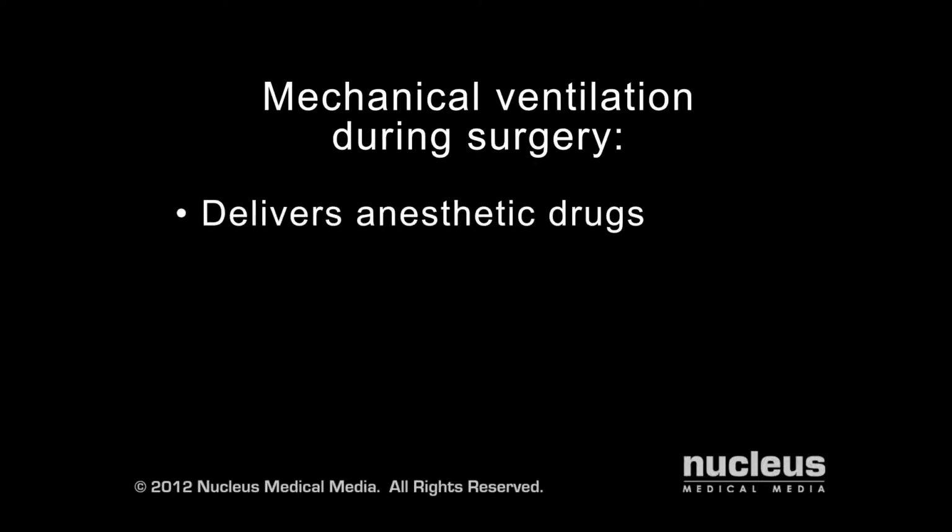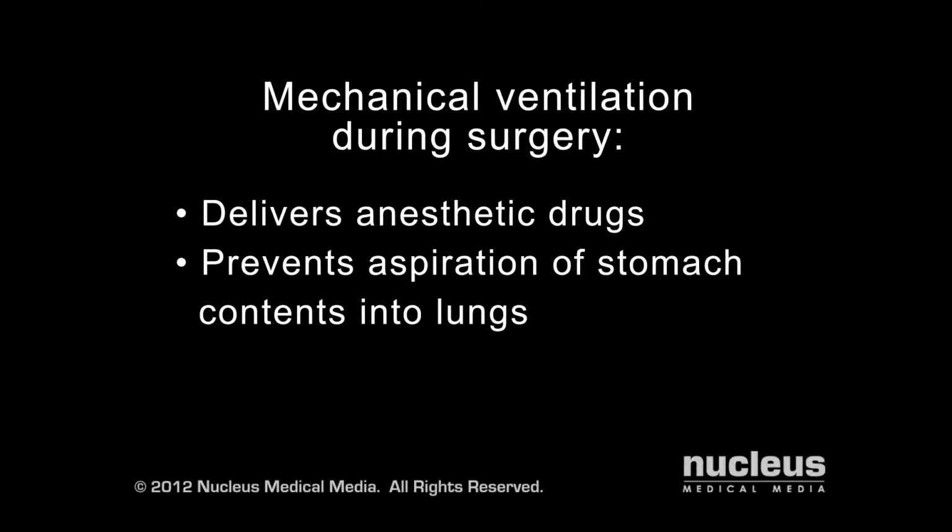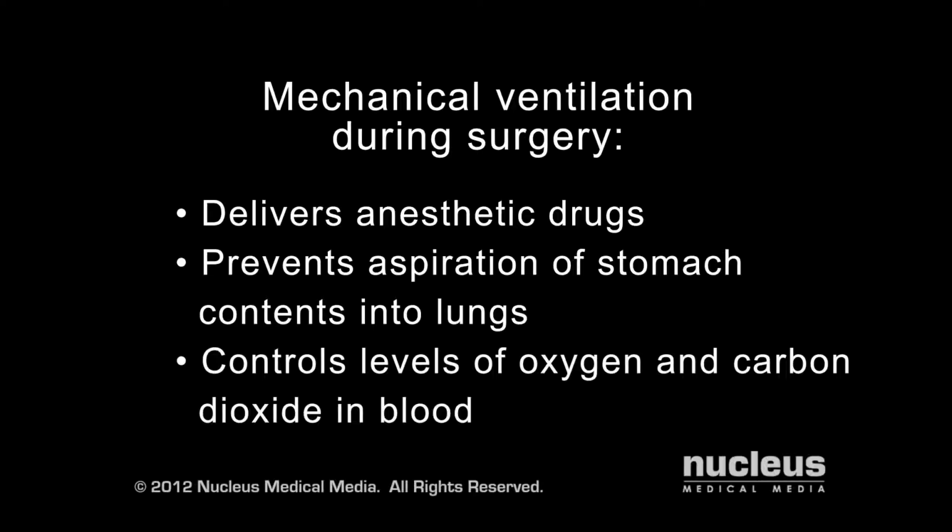Mechanical ventilation is also used during surgical procedures, for delivering anesthetic drugs, preventing the aspiration of stomach contents into the lungs, and closely controlling the levels of oxygen and carbon dioxide in the blood during surgery.